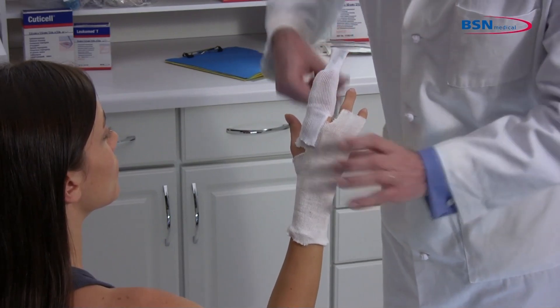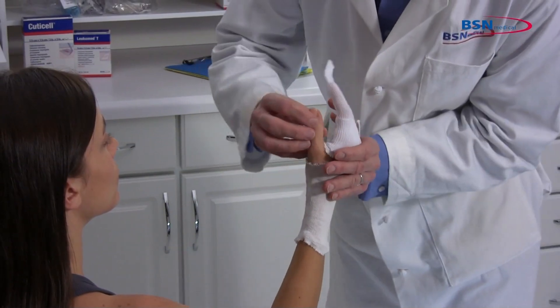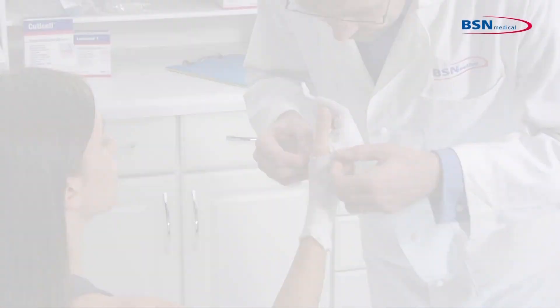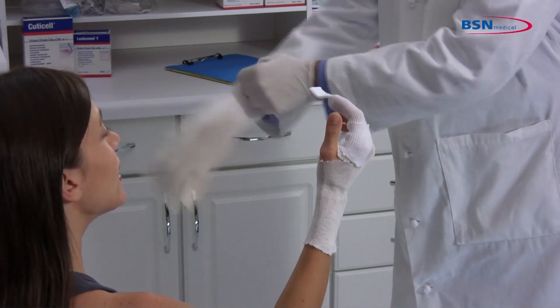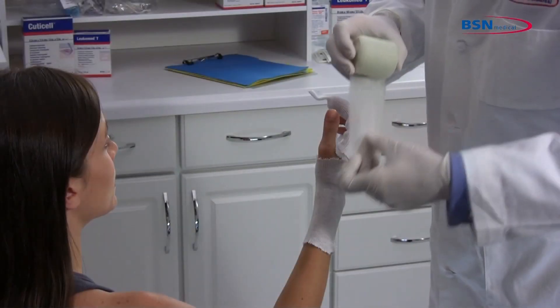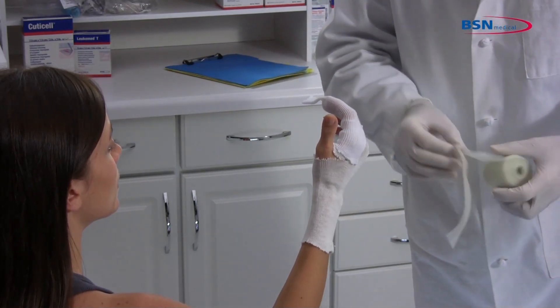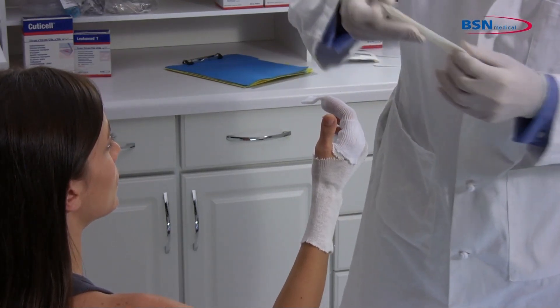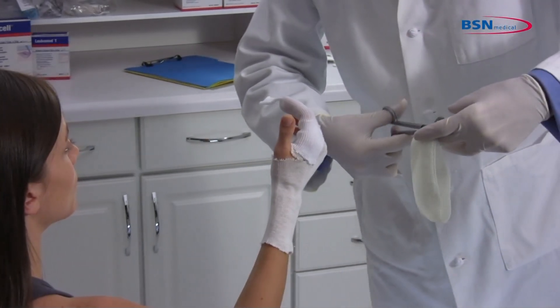Make sure the patient's limb position is correct before starting to apply the cast tape. Begin by putting on protective gloves before applying the cast tape. Measure using two-inch or three-inch cast tape from the proximal phalange of the thumb to below the wrist to use as a reinforcing strip. Fold over to make two layers and cut.